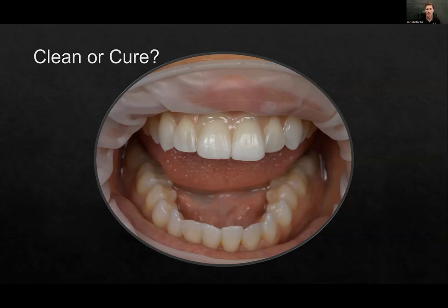I don't want to have a very small area in a margin that didn't get resin, okay? So I want to make sure I can see it everywhere, so I make sure to put a uniform coating everywhere. So I'm not having to worry too much that resin has to move a lot underneath the veneer, that I pretty much coated it already in the beginning.